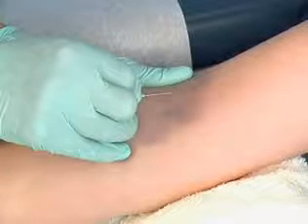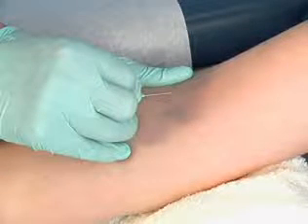Position the needle with the bevel facing up. This allows easier entry into the skin and the vein, resulting in less pain for the patient. To anchor the vein, grasp the patient's arm with your non-dominant hand and place your thumb to the side of the puncture site. This position keeps your thumb out of the way of the winged infusion set, so you can maintain a 15-degree angle when entering the vein.